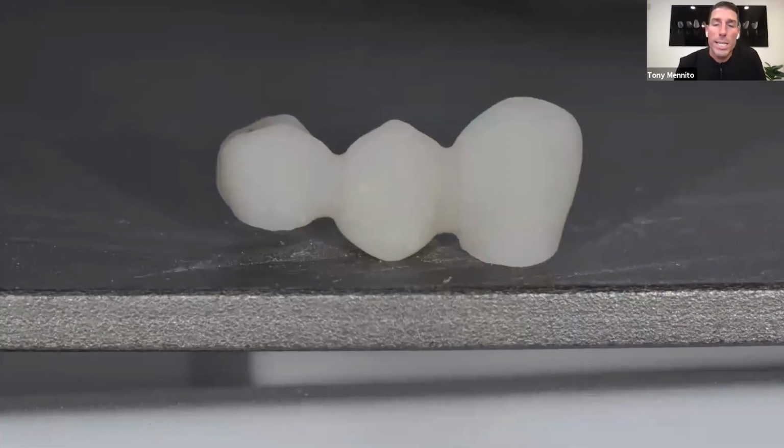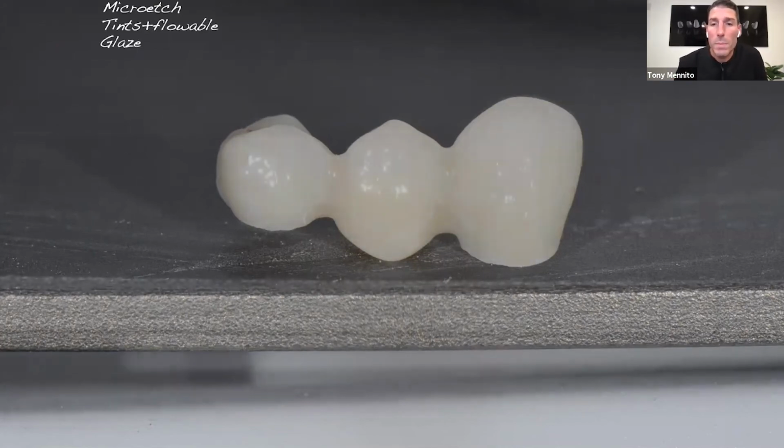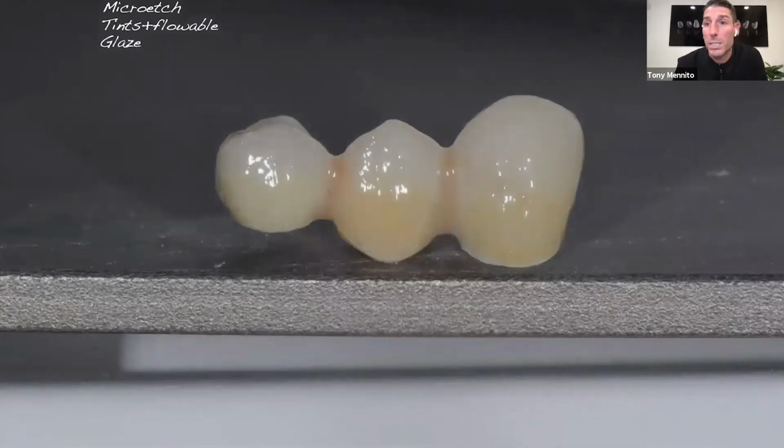So this was a case that we milled at a Telio CAD. We only had one shade of Telio CAD at the time, and so I really needed to basically stain and glaze this using what I'm showing you here, air abrading the tooth, put some tints and some flowable, and basically try to make it look as much like the patient's dentition as I could.